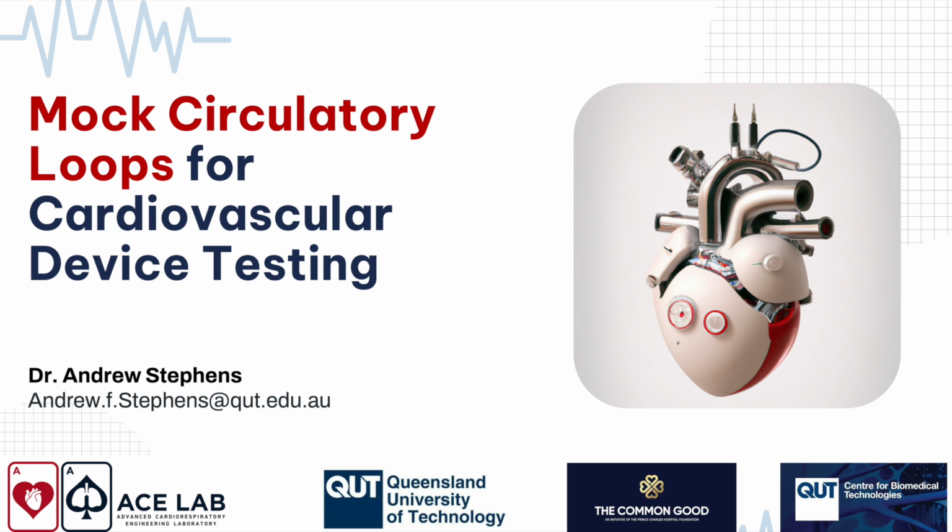Well, what is a mock loop? So essentially, it's a representation of the cardiovascular system. It's really just a bunch of pipes and tubes, but each pipe and tube represents a part of the cardiovascular system and has been specifically chosen and designed to have a certain characteristic. And this is what we call a lumped parameter model, because each one of these little chambers represents hundreds of or possibly thousands of smaller blood vessels.